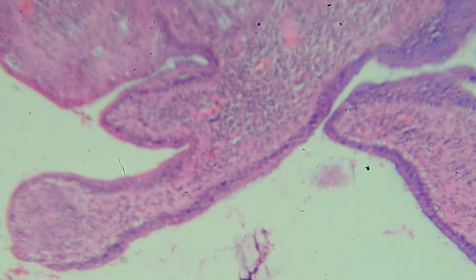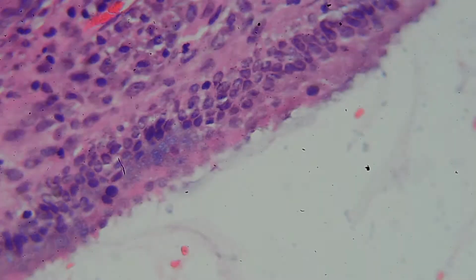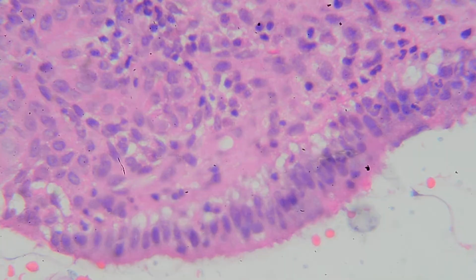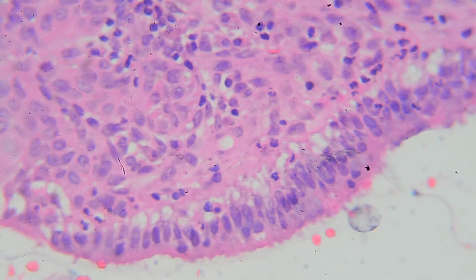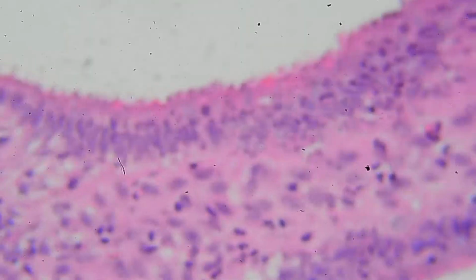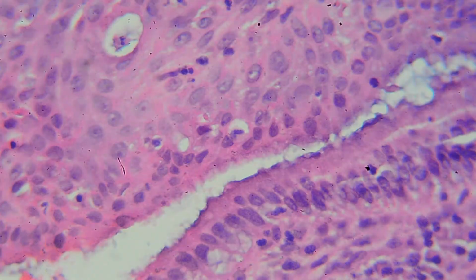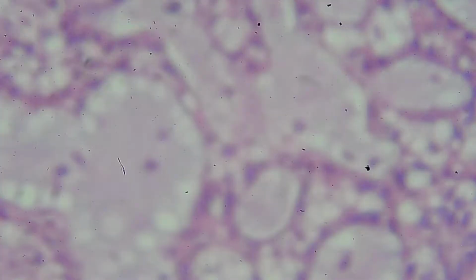And here, is it a stratified squamous? No, endocervical is simple columnar and mucin secreting. So these ones, you can kind of see they're secreting mucin. They're almost like goblet cells. So here you can see it's still kind of pink, but here you can see all of them, they're secreting mucin.